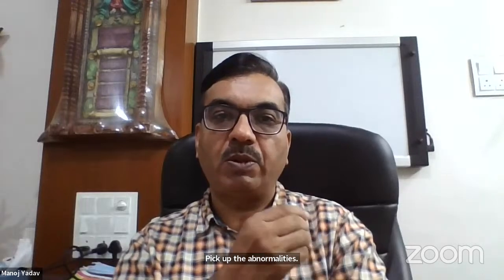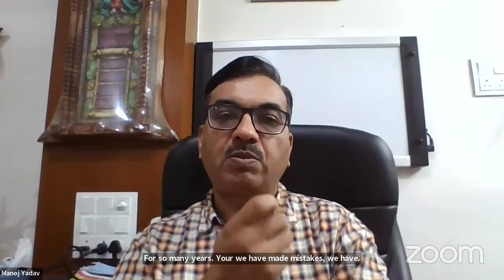For so many years, even we have made mistakes. We have missed a small pneumothorax, right? Or we have missed a small artifact, or sometimes we have overdiagnosed because of an artifact, right? So I think you should know how to interpret this.